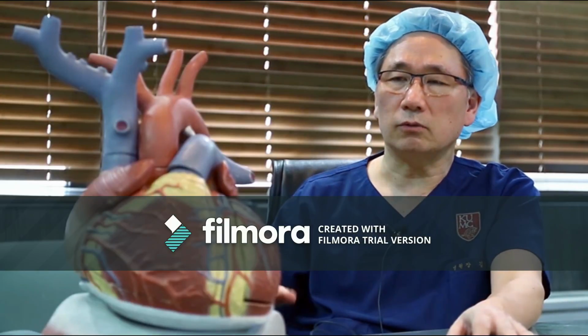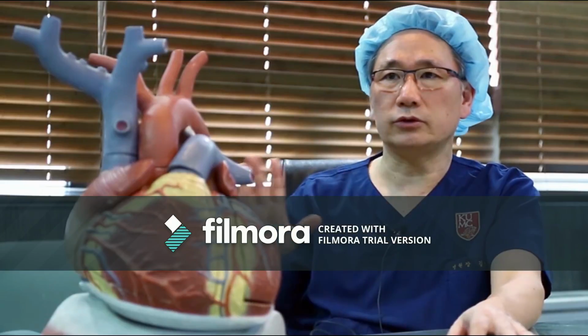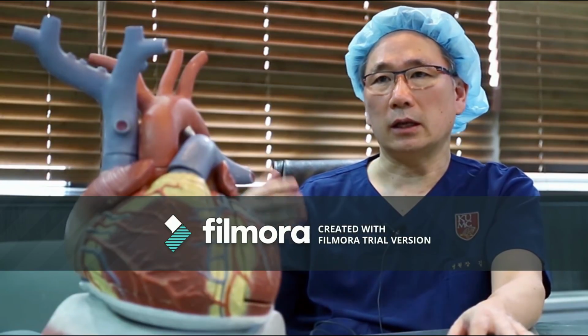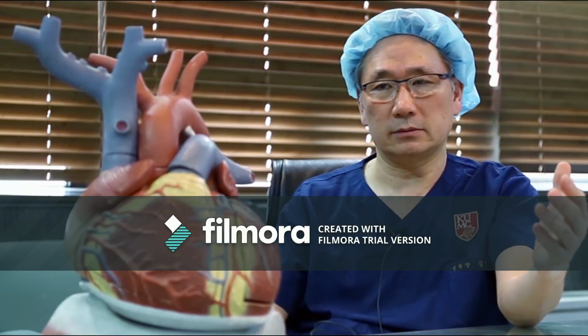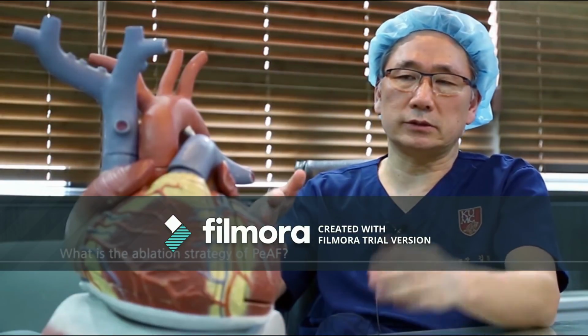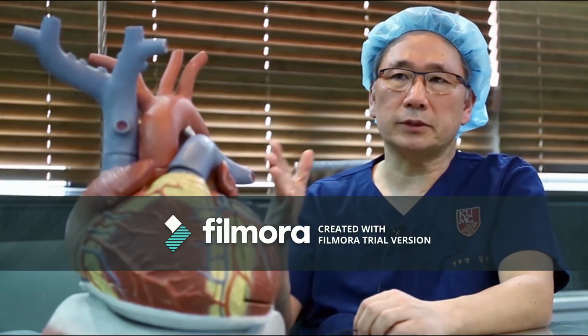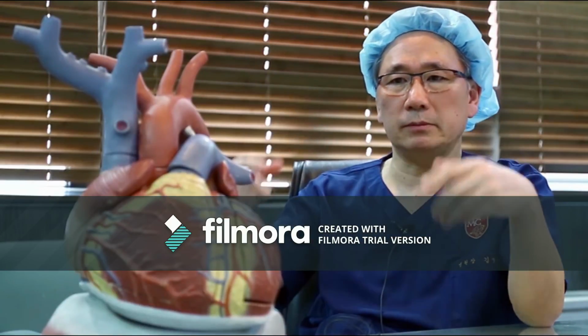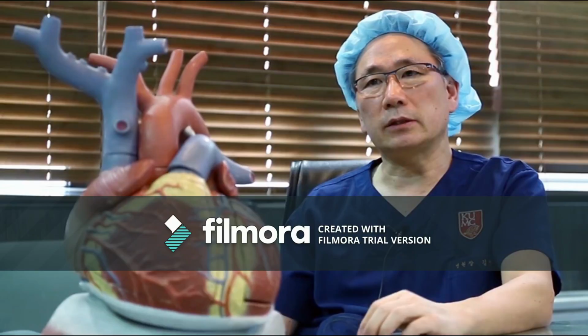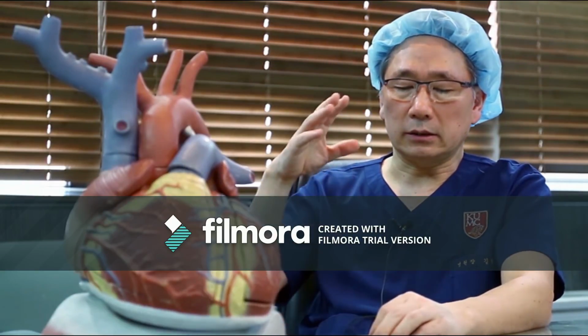After that we test again to see that there is no trigger anymore. That's our endpoint for paroxysmal AF. Persistent AF is different. So pulmonary vein isolation first while the AF is ongoing, and I think in less than 20% of the patients, only PVI terminates atrial fibrillation or converts it to atrial tachycardia, but in most cases AF is sustained.